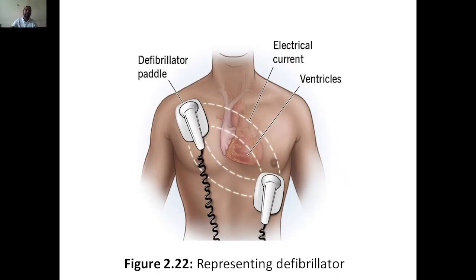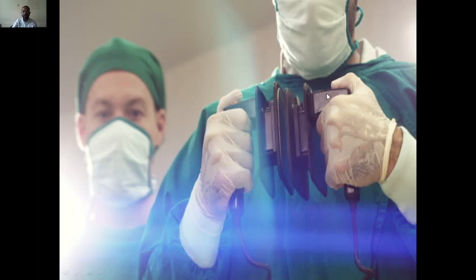So this is exactly what the defibrillator looks like. These are the paddles, what he is holding now. Here the electrodes will be there. Here the shock will be given.